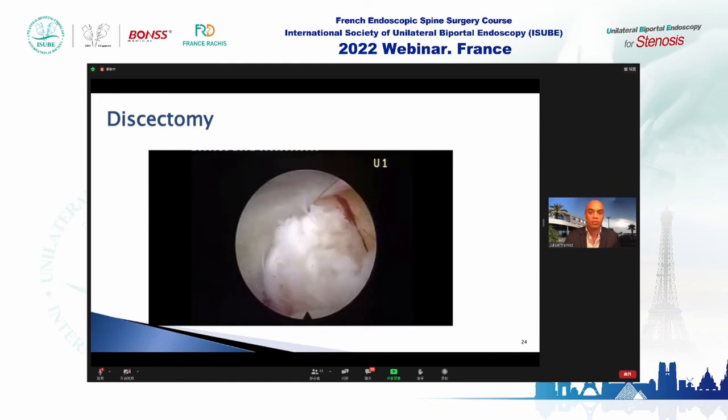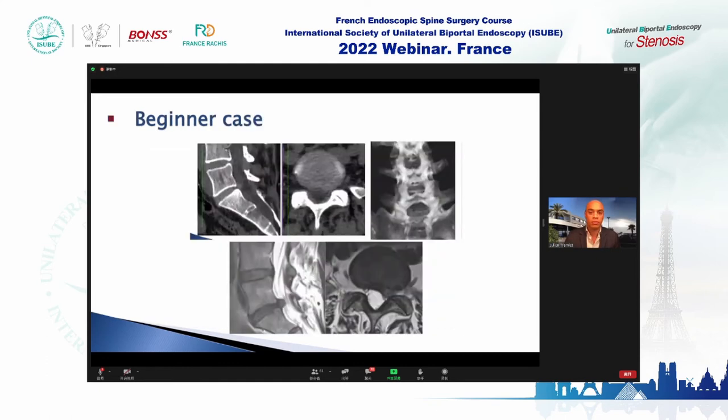Here is a specific beginner case example. You can see the CT scan with a 3D reconstruction giving a good view, and the MRI showing the disc herniation. The interlaminar window is big enough for this approach.